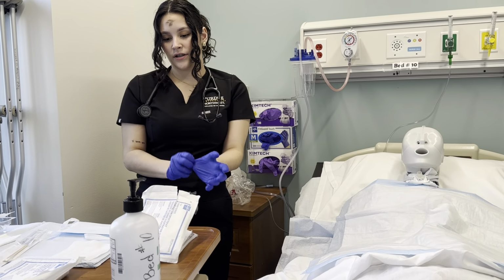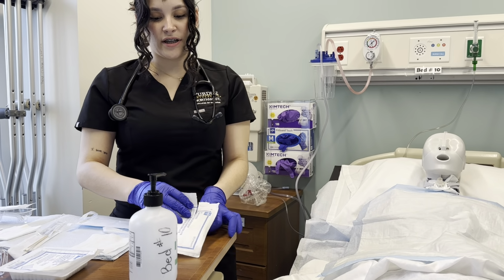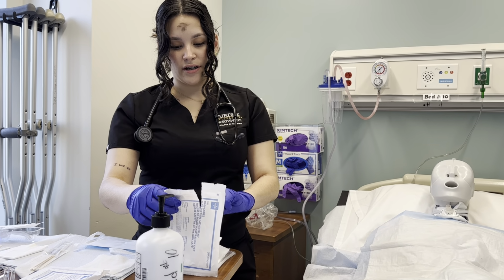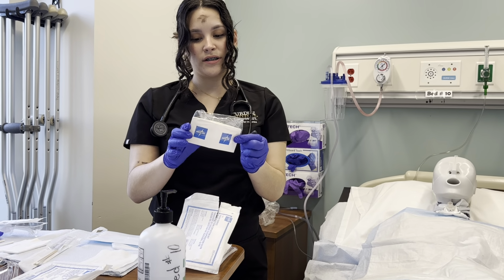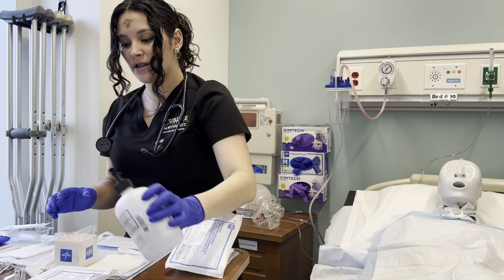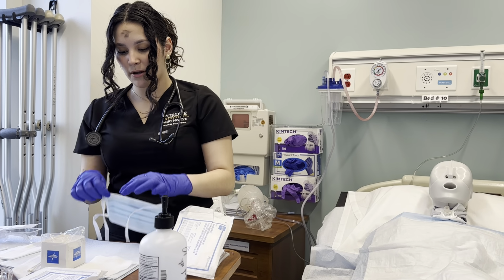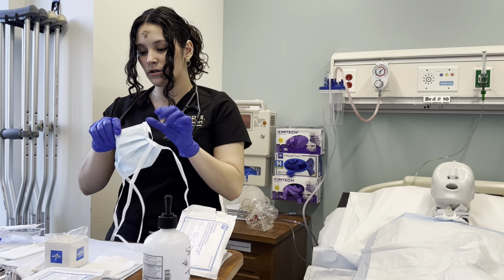And I'm going to open the suctioning package, catheter kit, gently pull out the sterile saline box and set it up. Pour some sterile saline into it. Now I'm going to put on my mask and goggles.